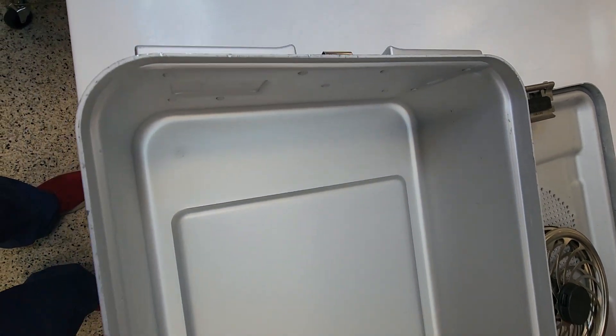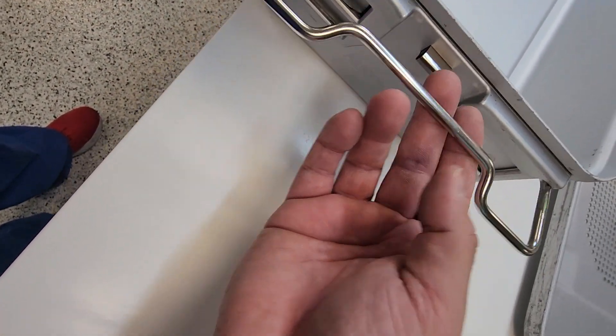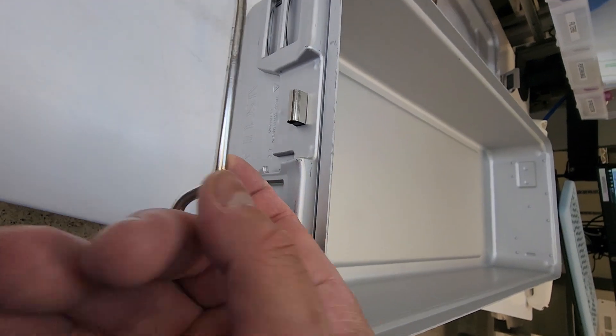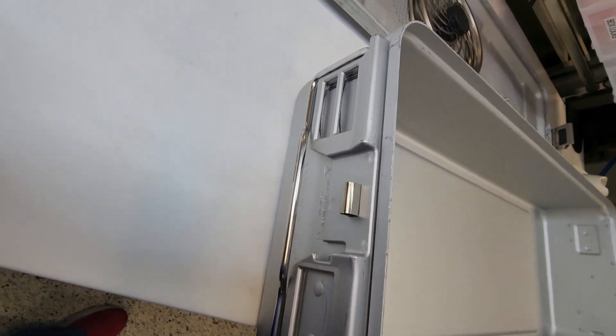We want to go ahead and examine the handles. Are the handles in place? There are two sides. We just inspected the base — everything looks good. Now we are going to inspect the lid.